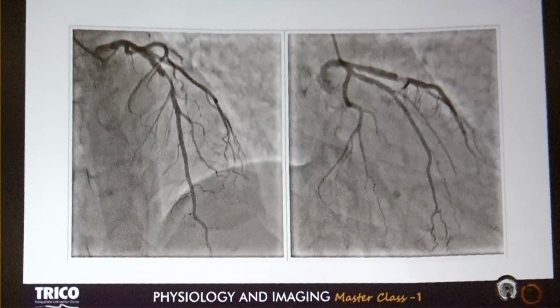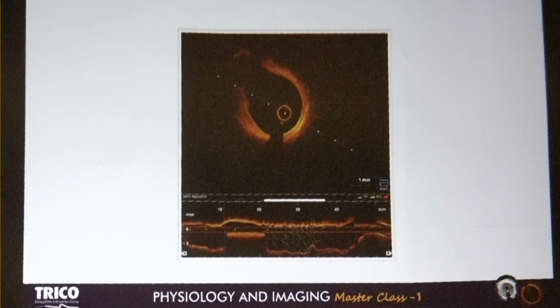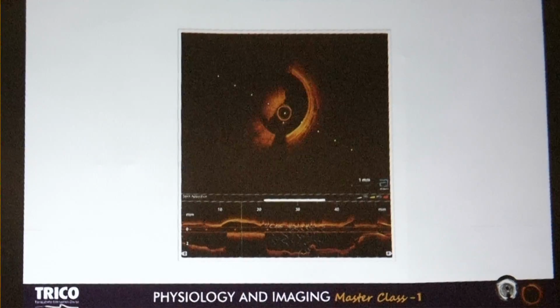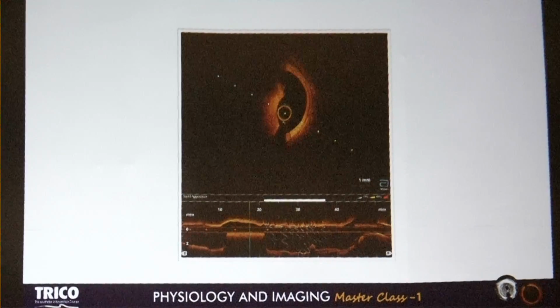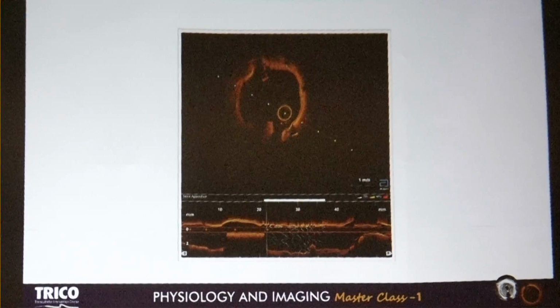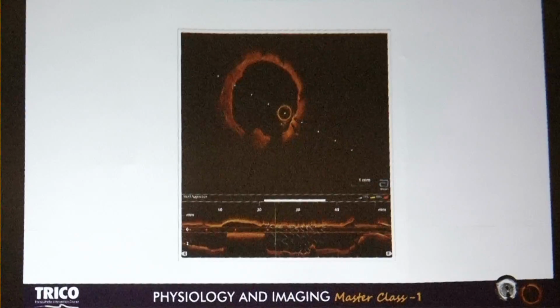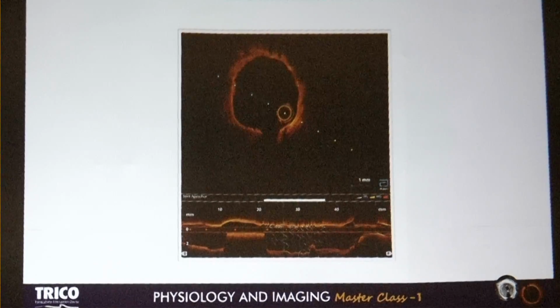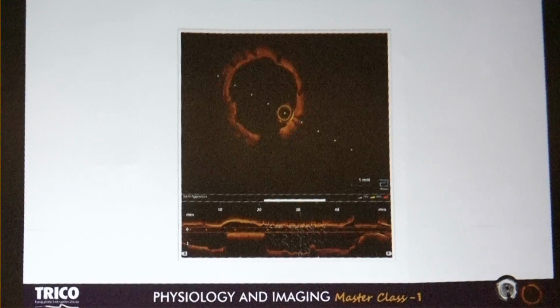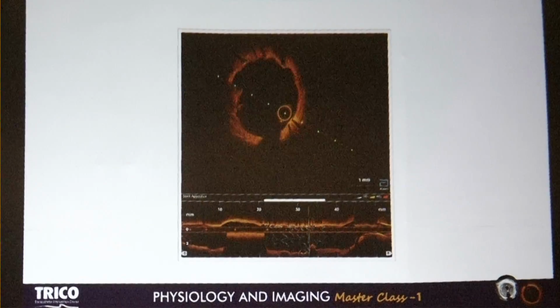Makes sense. Now we are doing imaging. This is all white thrombus, and in the disturbed area and the area which looks great, just concentrate on the OCT image of this area and see what you see inside.